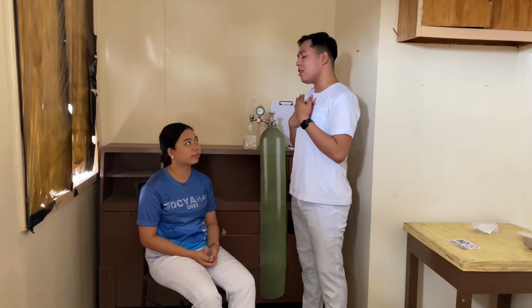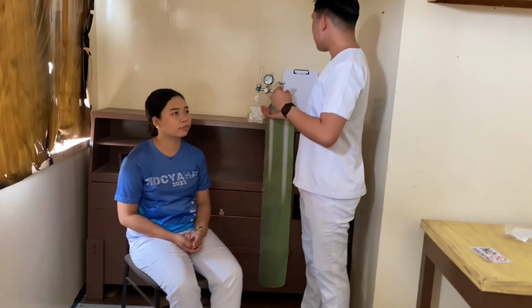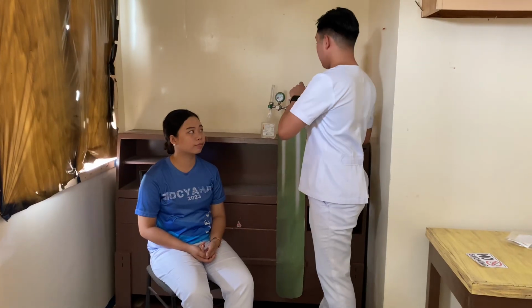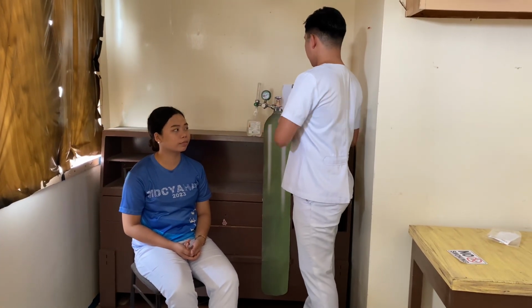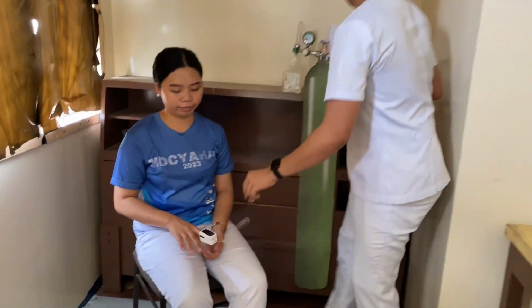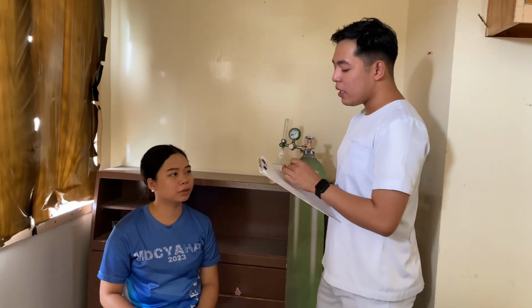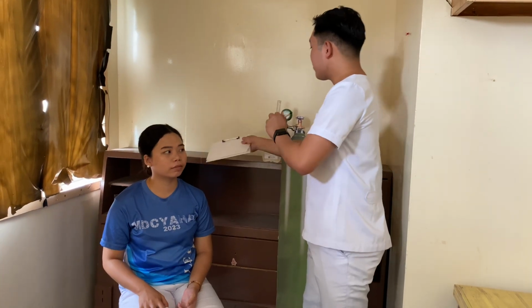So good morning, ma'am. I'm Yusef from Matthew Doctors College, your student nurse. So now ma'am, I will put the pulse rate on you. Ma'am, may I ask your age? 25. And your name, ma'am? Anilin Lauren Sharma. Thank you po.